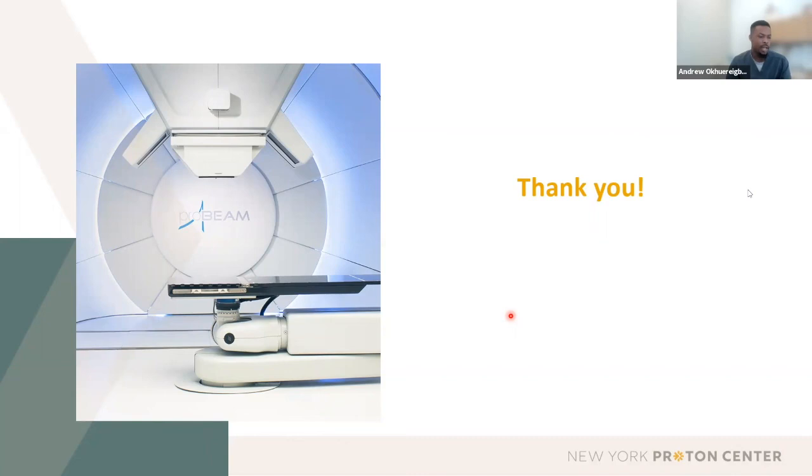So yeah, many things go into determining that 45-minute time. The biggest thing is how many gantries you have in the facility. We have 4 gantries here at the New York Proton Center. So we have to keep in mind patient beam wait time, as well as how long it takes for a patient to actually get into that breath hold on a regular basis. When we first started treating patients, we started scheduling them for an hour. And then as time went on, after about 4 or 5 months of learning the system and learning how to schedule efficiently, we started scheduling SDX patients back to back.